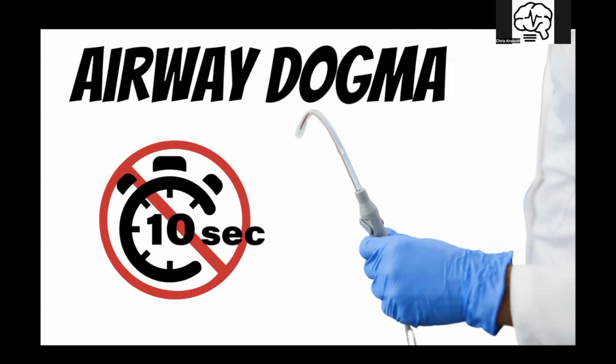And we have got to stop this no greater than 10 seconds, 10 seconds suctioning maximum. If you don't get the stuff out of the airway and you put the bag valve mask back on and push positive pressure volume in there, you're going to ram it down deeper. If you're going to suction to get stuff out of the airway to prevent aspiration, get it out of the airway. It's XABC. Stop exsanguination, airway, breathing, circulation. They're not bleeding out and you're managing the airway and there's stuff jammed in there. Get it out. If you go 11 seconds, the person's not going to die an irreversible death.